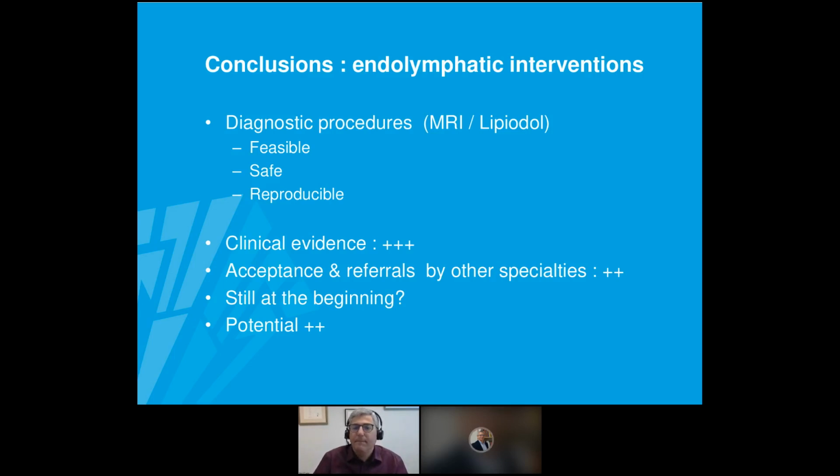Thank you, Geert. In case of the presence of right-to-left cardiac shunts, what contrast agent will you use? Do you still use Lipiodol? Well, that's indeed a good question. This is especially for patients with plastic bronchitis or thoracic indications. You can, of course, exclude the presence of a right-to-left shunt by cardiac ultrasound. I think you have to do it always.